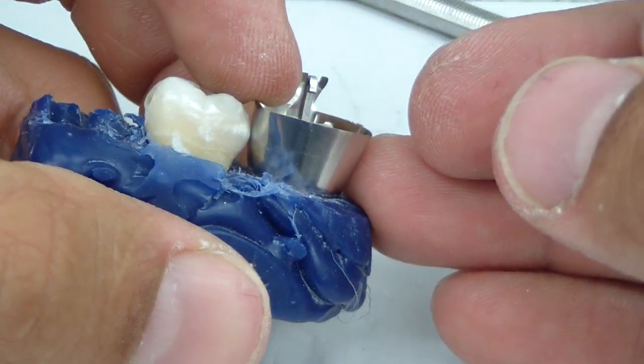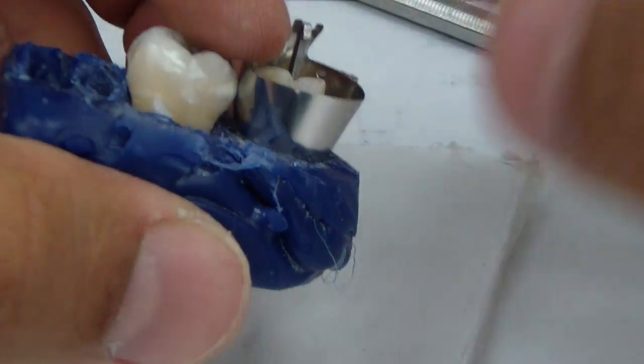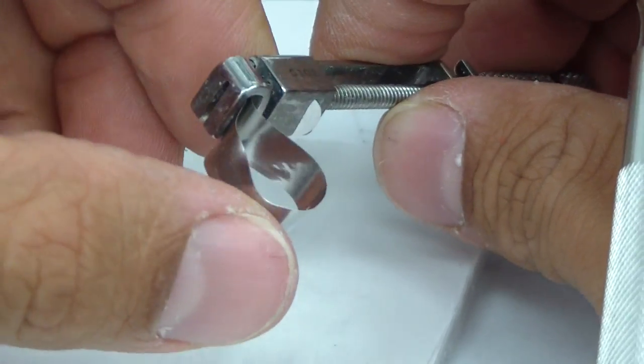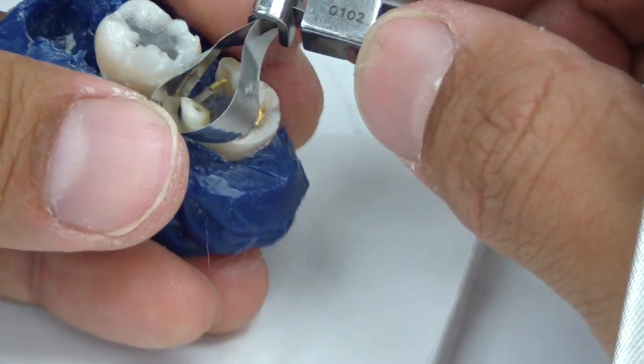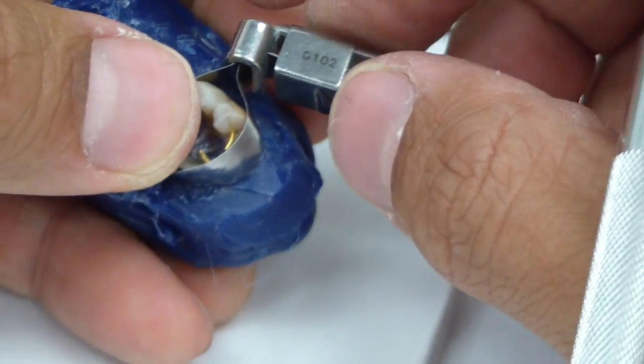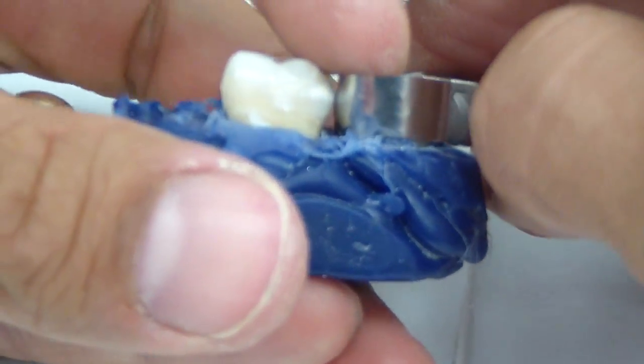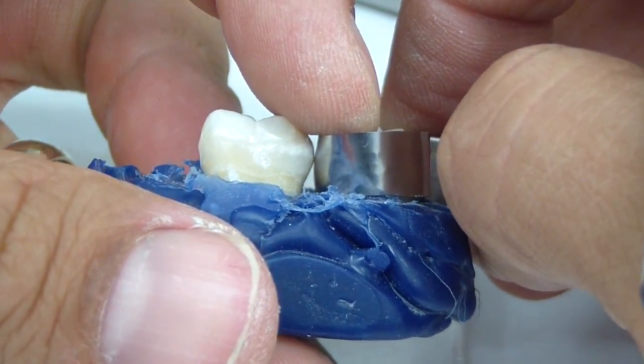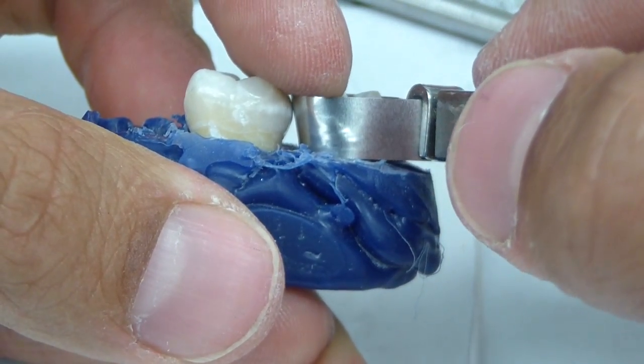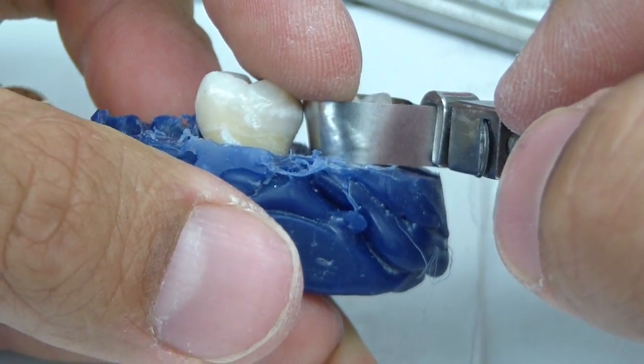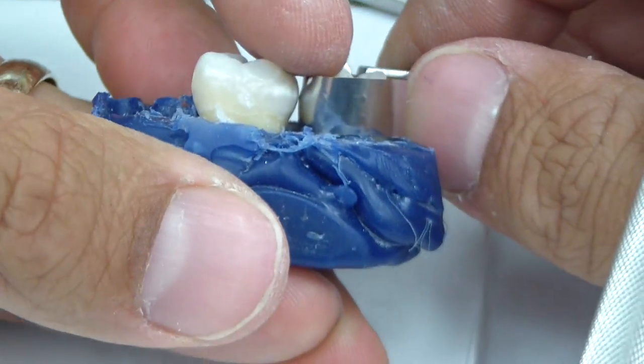So how did I do that? Well, a lot of textbooks, and actually even Dr. Queso was showing me, extraorally, and I did that with actually Toffelmeyer as well. You can see I burnished it here. You can burnish this, and we'll continue to burnish it intraorally, but just that pre-burnishing aids to develop that contour versus just that flat. If I spin around, there's just that flat surface and back to that nicely contoured.